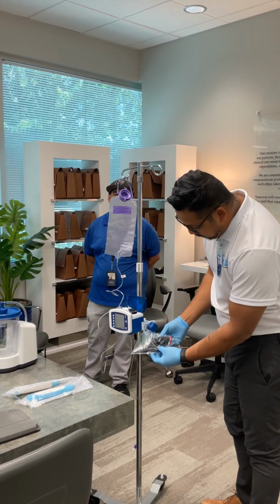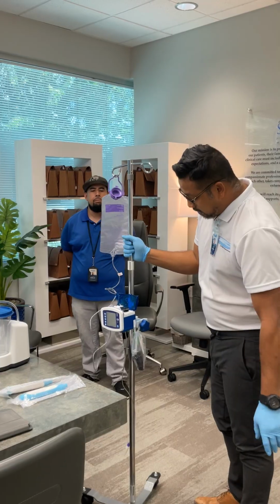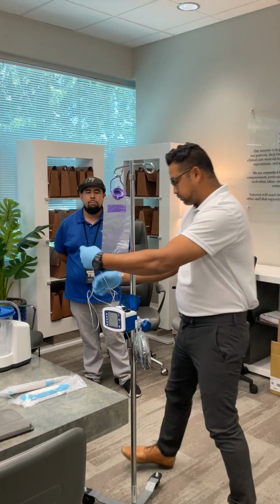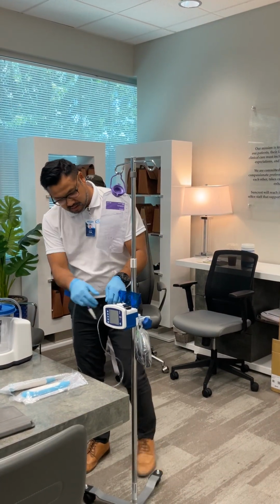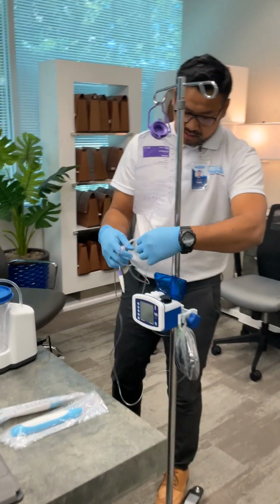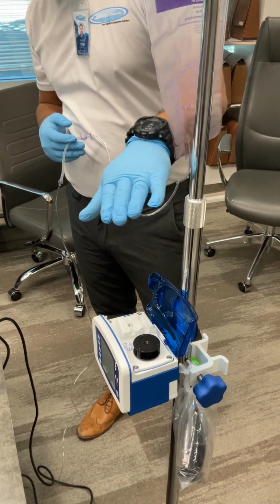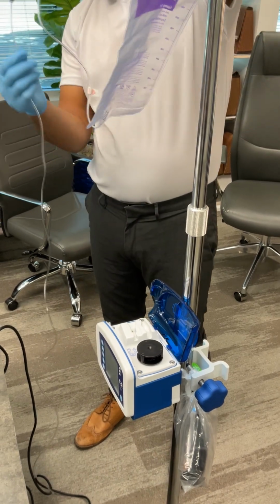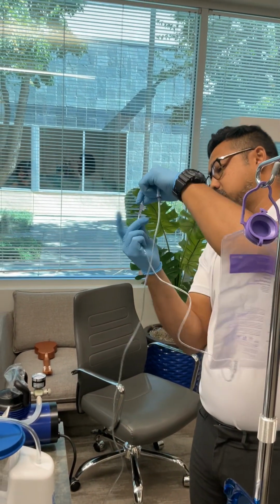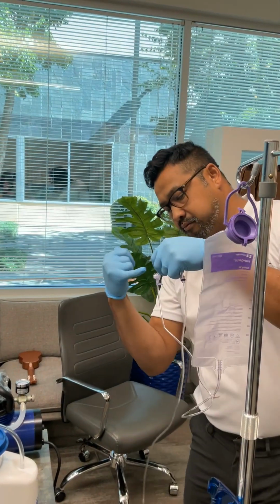And there is an AC/DC power adapter here that goes to a standard 110 outlet in the house. Other than that, once you load your cartridge, there is this particular unit that we carry. There's a specific method to attach it. Pretty much you want to have the bag hanging at about 6 inches or more above the actual device. And then there's a section of it that has a stretchy bit that's silicone. And then there's a tab right here. And on the underside, there's a cutout where the metal cam would sink into there.